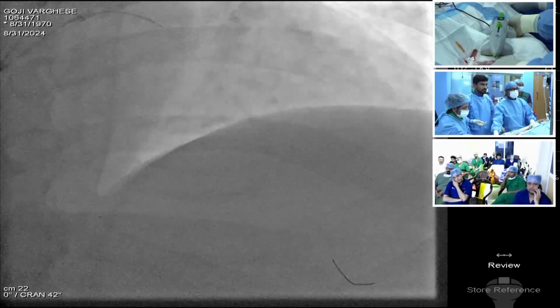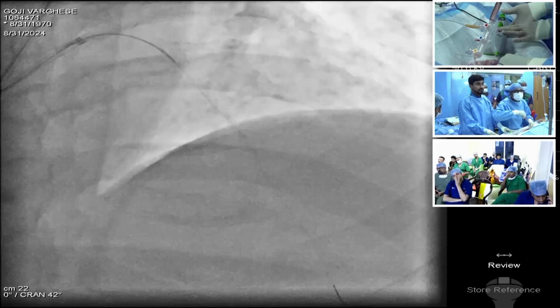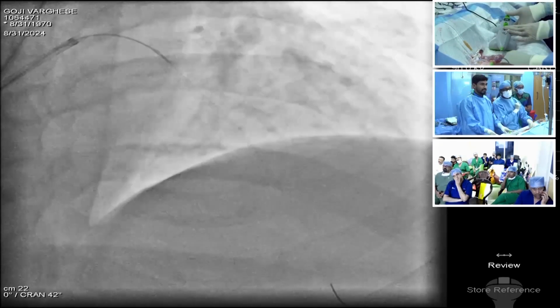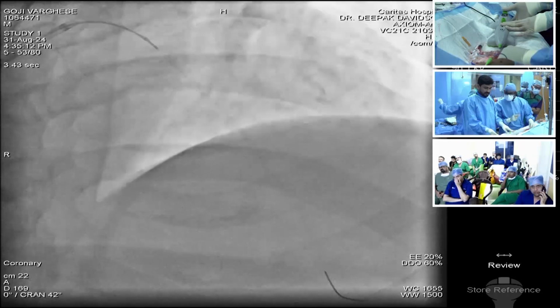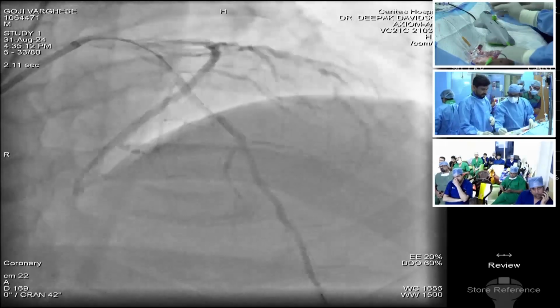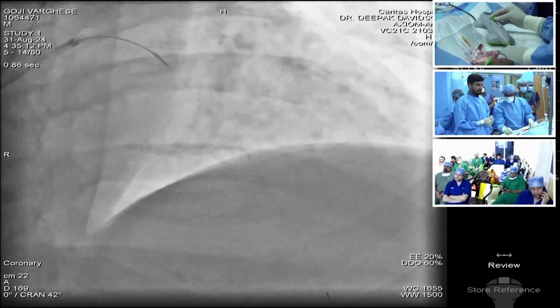You will centralize. Okay. We'll take a small cine to see whether it is... Yeah, that area is the calcium. We'll do that at high speed straight away and down. Yeah, we'll put the brake. We'll straight away go at higher speeds because that's almost a 4 millimeter vessel.